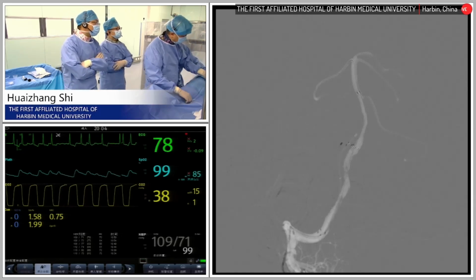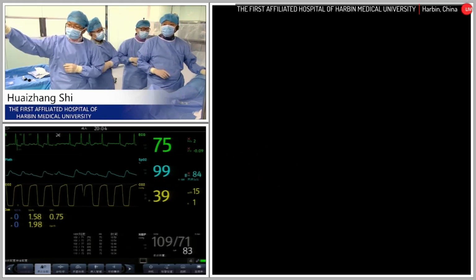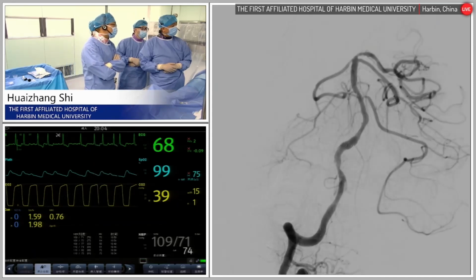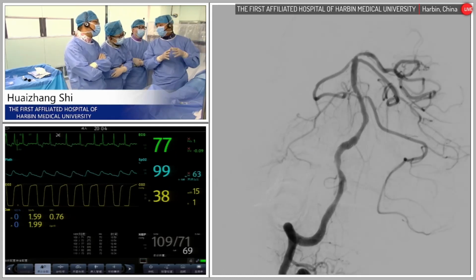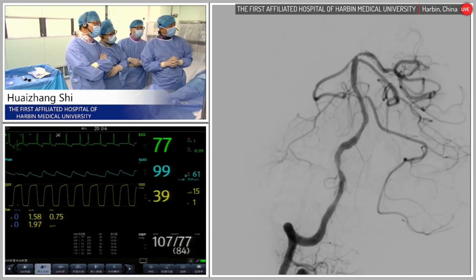Oh, okay, it's a delayed angiography. Oh, a dissection here, we can see the dissection here. So if we just leave it alone and not put the stent here, that may cause some problems, maybe the future result is not good.